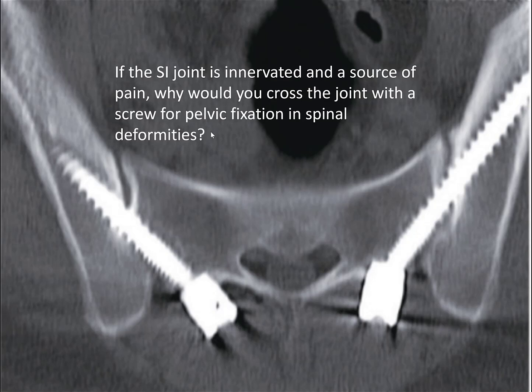If I put a screw across a joint of your wrist, and it doesn't fuse, you would think it would cause symptoms. We don't put screws across joints without doing something to the joint. That's sort of like orthopedics.